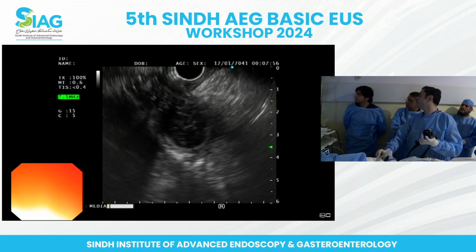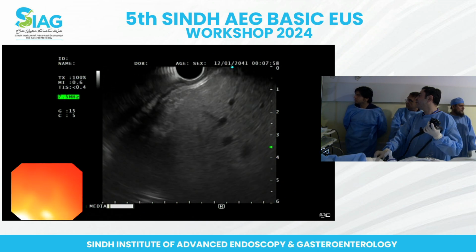At this level. What's our specimen looking like?